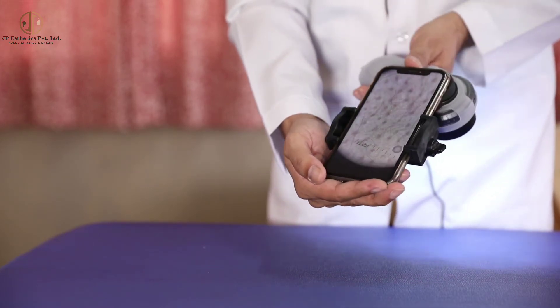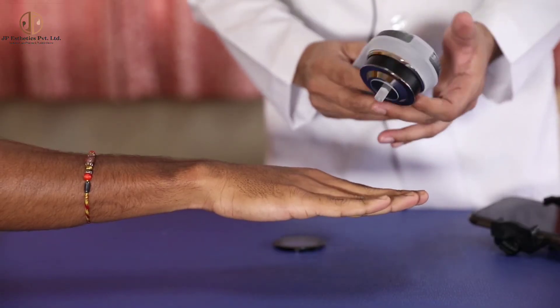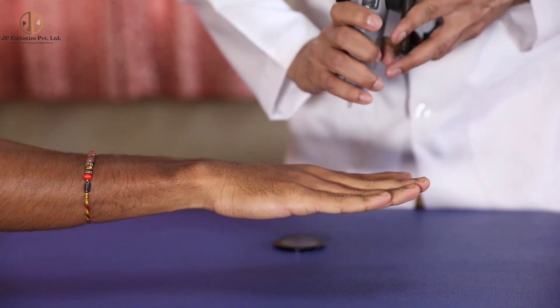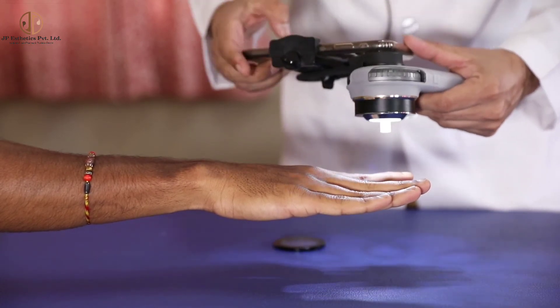If we want to examine slightly smaller areas, for example the web space, this dermatoscope has the facility to attach a new smaller probe. We can remove this face plate and attach this small probe, which allows us to observe the web space and other inaccessible areas to capture images. I will show you that as well.